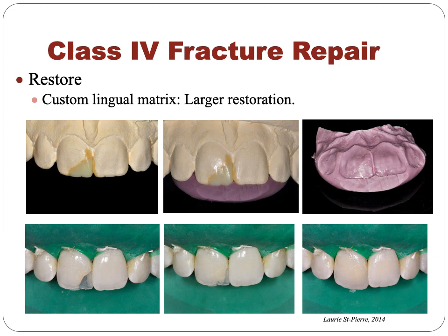In the purple color. After that, we will bring the patient again and place this lingual matrix on the lingual surface, and then we will use it as a matrix and build the lingual surface, and then we will use the Mylar strip to build the proximal and the labial area, and finally we will finish our restoration. So this is the indirect-direct technique, and the first one that we spoke about is the direct technique.